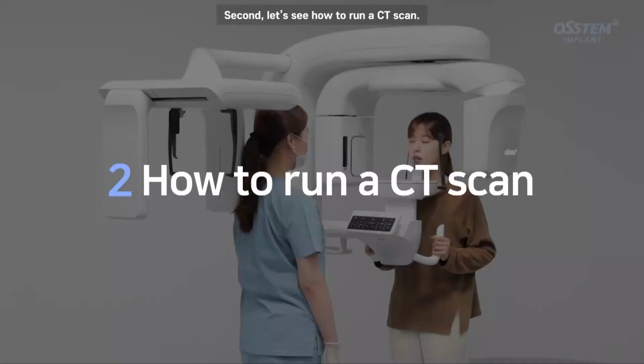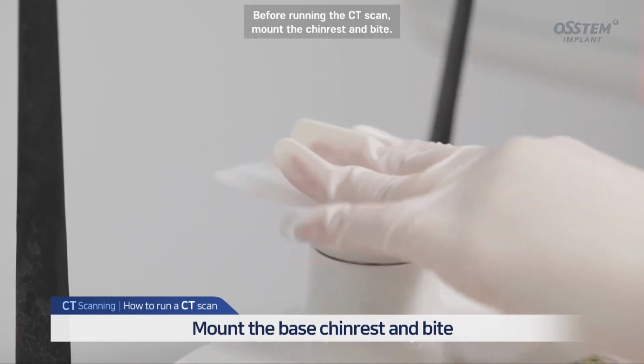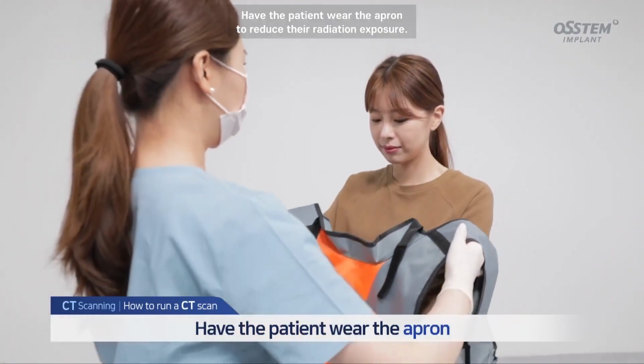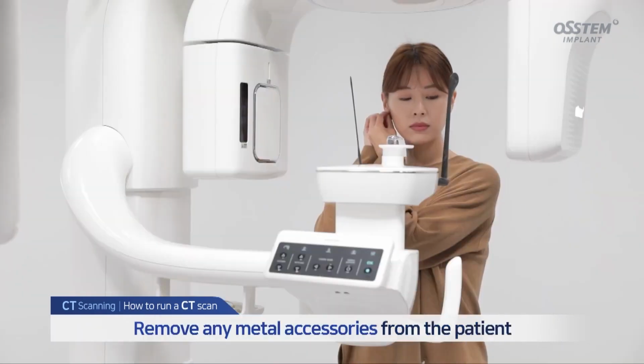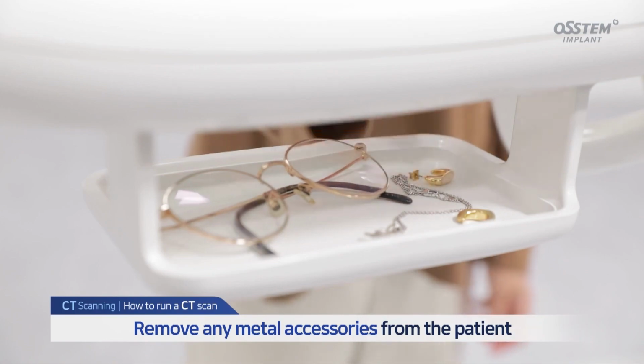Second, let's see how to run a CT scan. Before running the CT scan, mount the chin rest and bite. Have the patient wear the apron to reduce their radiation exposure. Remove any metal accessories from the patient and place them on the cradle.